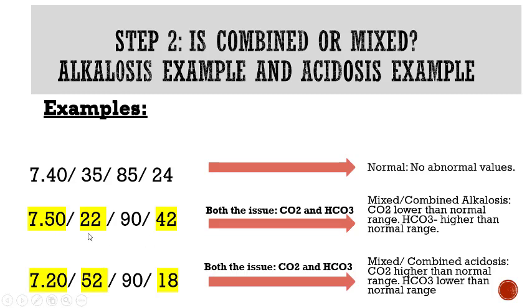So you're always kind of looking for the balance between your CO2 and your bicarb. The oxygen is something that you guys are going to interpret as well, but that's going to be interpreted just kind of by itself. Oxygenation is kind of its own component. These three, your pH, your CO2, and your bicarb, are that Henderson-Hasselbalch equation. You have pH equals bicarb over PaCO2. The balance between bicarb and CO2 is really what's going to determine your pH. So you want to be looking at what is abnormal, what does it mean, and how do they compensate or balance one another.